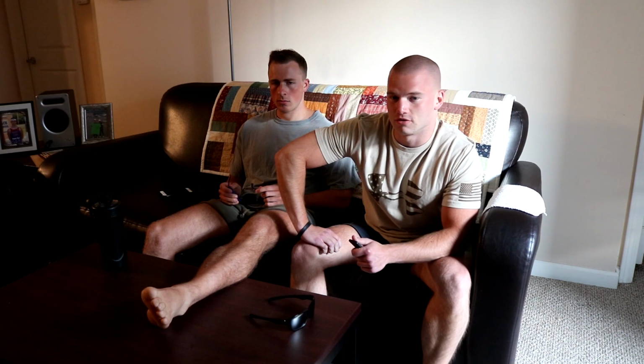This week we're going to be playing around with light therapy on Josh. So what light therapy is, it's a physical agent used in the clinic for a multitude of reasons. Today we're going to look at pain management for his quad. This is a chronic injury. Some of the effects of light therapy include soft tissue healing.